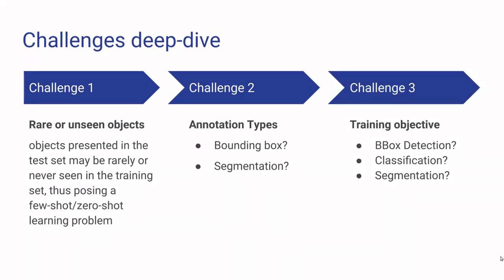Last but not least is our training objective. According to our metric, classification is the most important objective, but localization is also very important as well. The challenge is that we have multiple objectives, which are not standard in existing object detection frameworks.